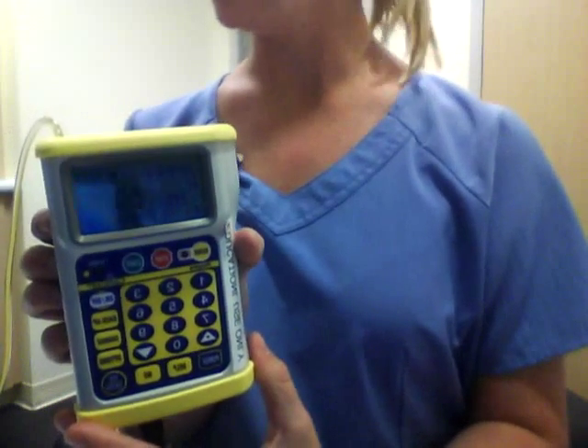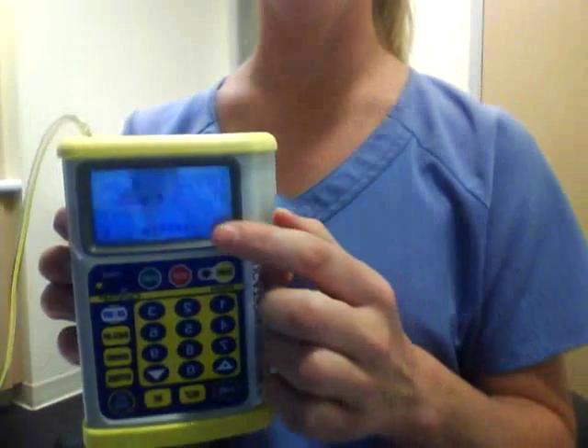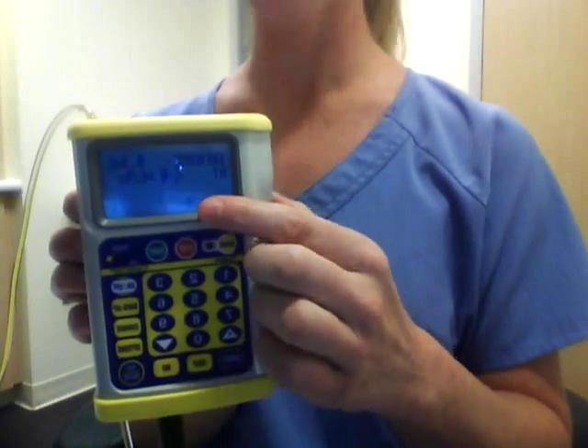And then to begin your infusion again, just press the start button. The arrows will be moving across the bottom when it's properly installed.